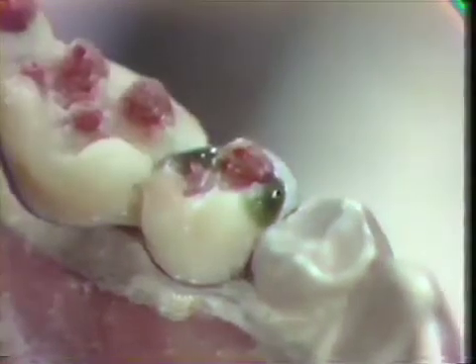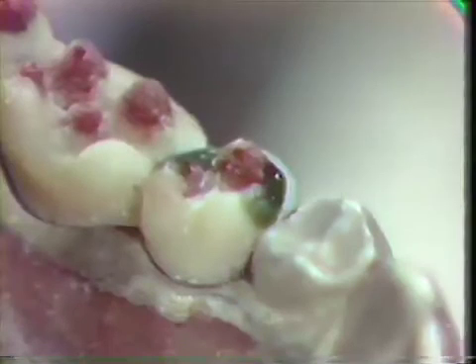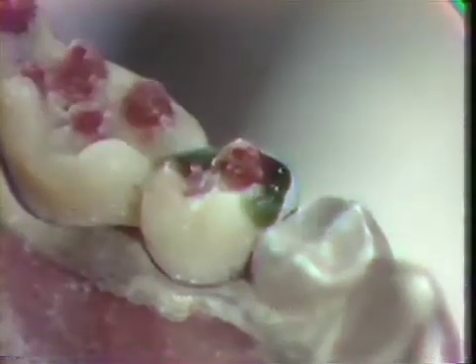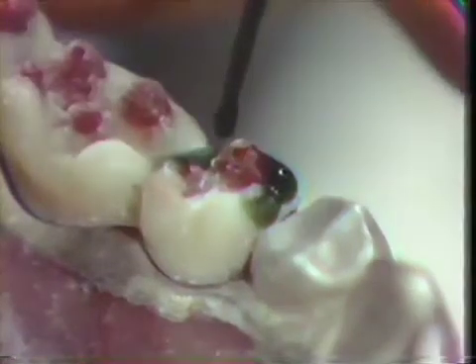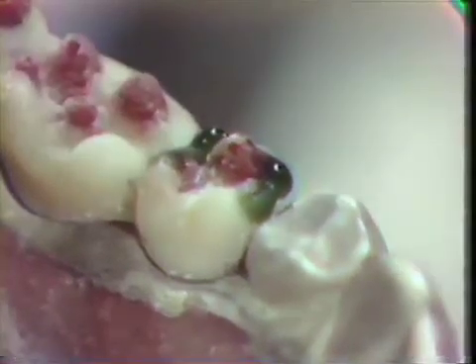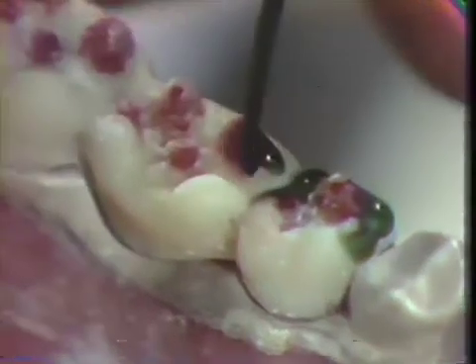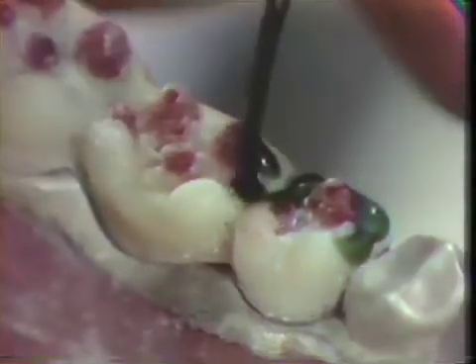As we develop this, we'll also be developing the mesial and the distal cusp ridges for each of our supporting cusps. We'll go ahead and complete this step, and we'll come back for step number 5.